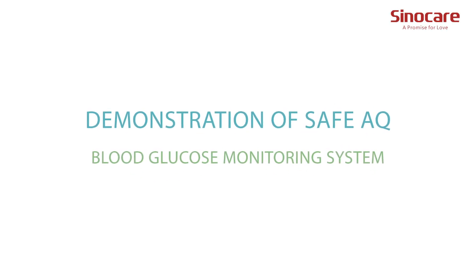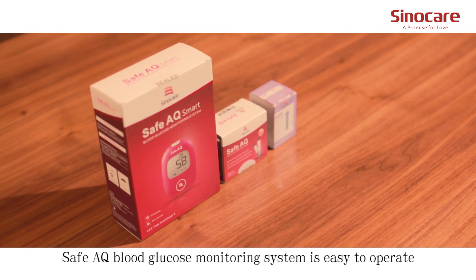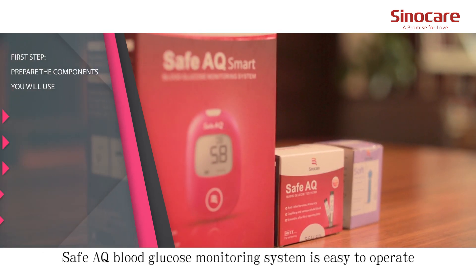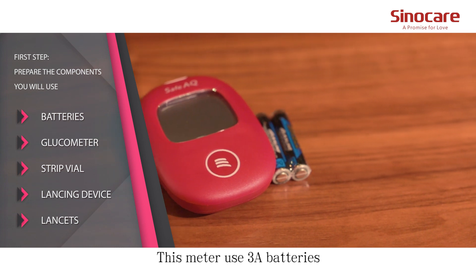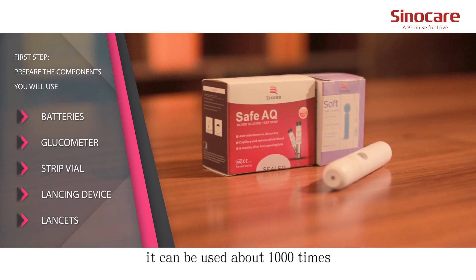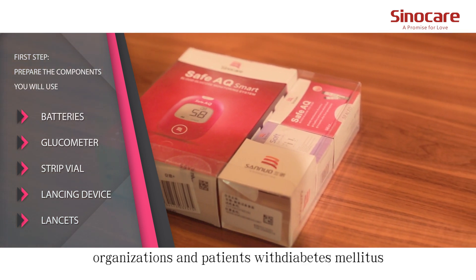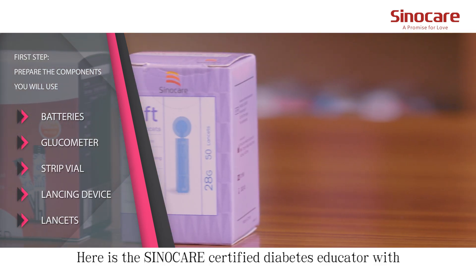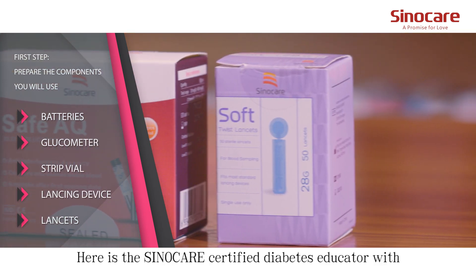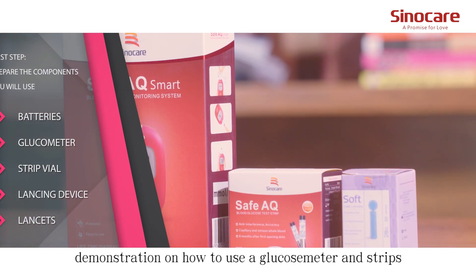Demonstration of the SafeAQ Blood Glucose Monitoring System. The SafeAQ Blood Glucose Monitoring System is easy to operate, convenient and speedy. This meter uses 3A batteries and can be used about 1,000 times. It can be applied to medical organizations and patients with diabetes mellitus. Here is the SinoCare Certified Diabetes Educator with a demonstration on how to use a glucose meter and strips.